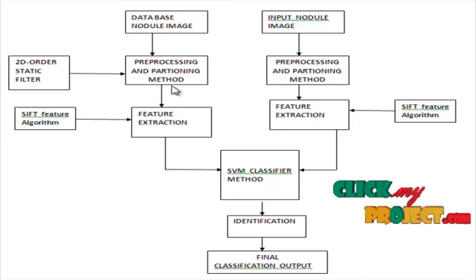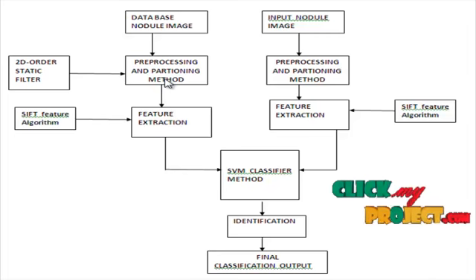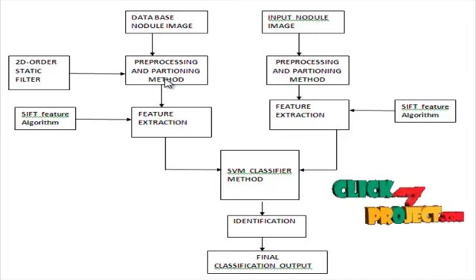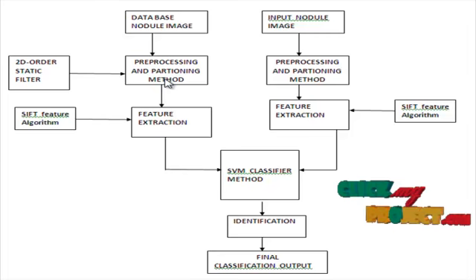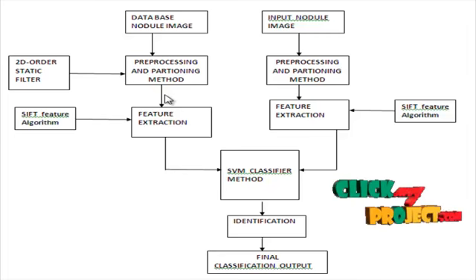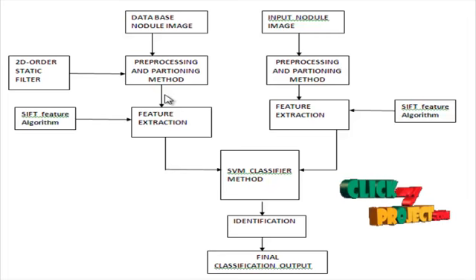Then go to the superpixel segmentation technique. Superpixel clustering is the process of dividing an image into multiple segments, which can incorporate local spatial information to reduce spurious labeling due to noise. In particular, quick-shift is a mode-seeking algorithm that can be used to partition the image into a set of superpixels, forming a tree of links to the nearest neighbor that increases the estimate of density. However, due to the small size of lung nodules, poor partitioning is often obtained when directly applying the quick shift method.